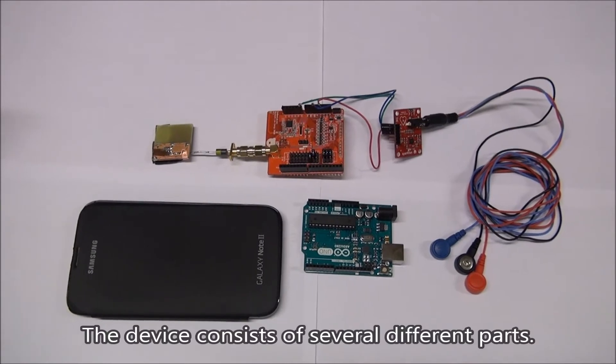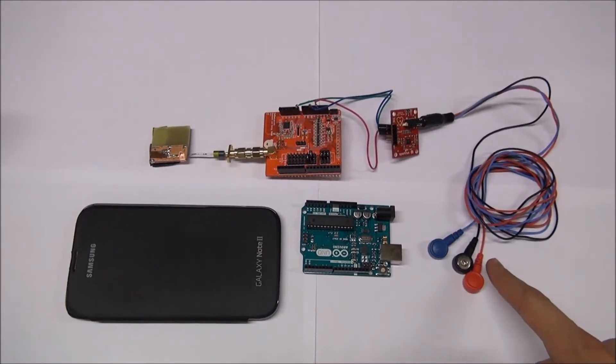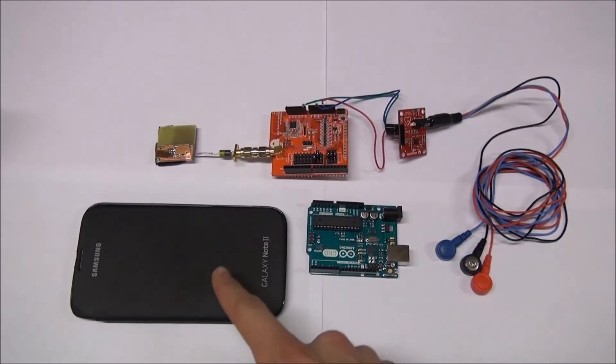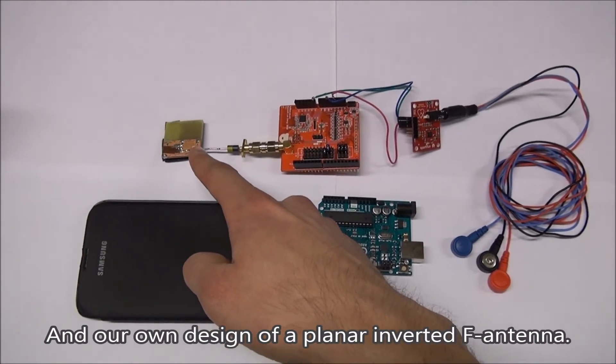The device consists of several different parts: an ECG sensor and electrodes, a microcontroller, a Bluetooth transceiver, an Android smartphone with an application, and our own design of a planar inverted F antenna.